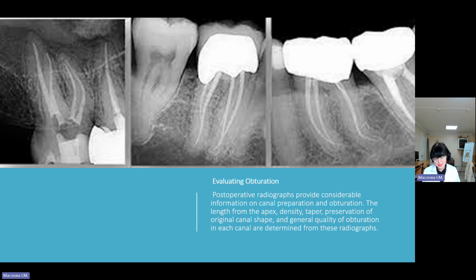Some complications can arise during or after a root canal procedure due to poor understanding of the anatomy and iatrogenic errors, mainly during instrumentation. While some of these problems can be anticipated, many can never really be predicted.